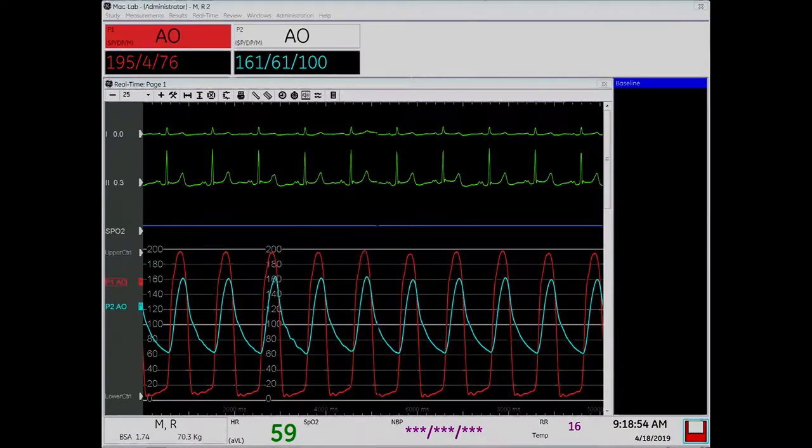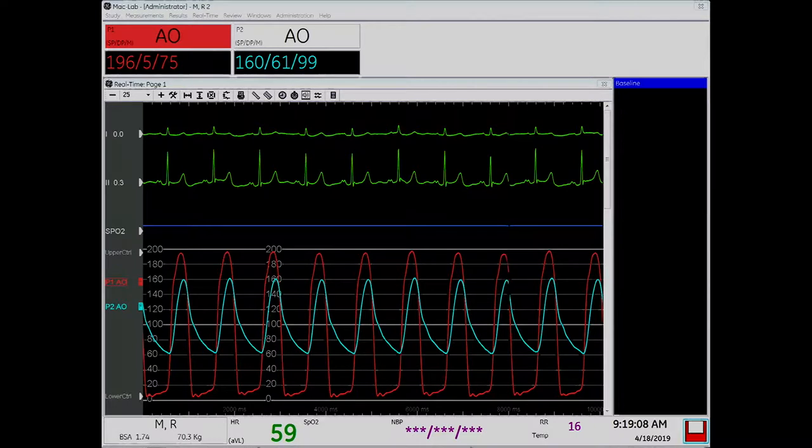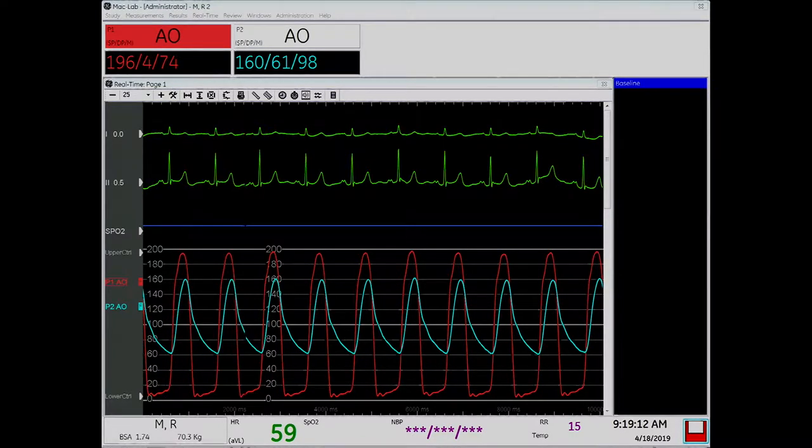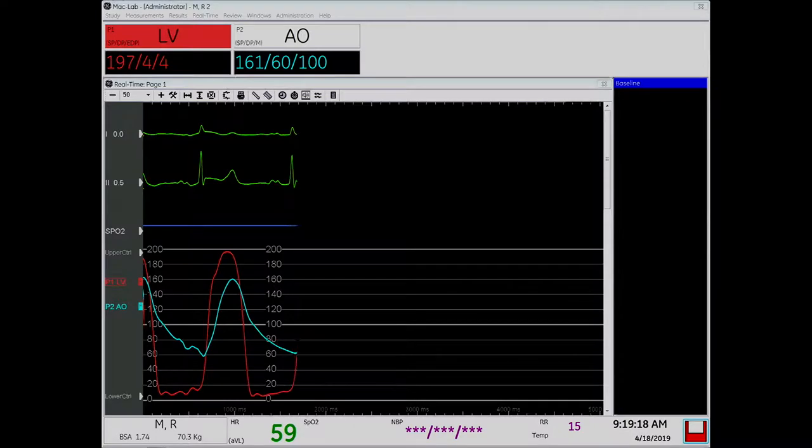You can see that the blue line peaks a little later than the red line. That's called pulsus tardus, because of the obstructed valve. So what's going on there is the pigtail in the ventricle is the red, that's the higher pressure, and the pigtail in the aorta is the blue, and that one peaks a little later, as you can see. When we're done, we want to see those two line up perfectly.